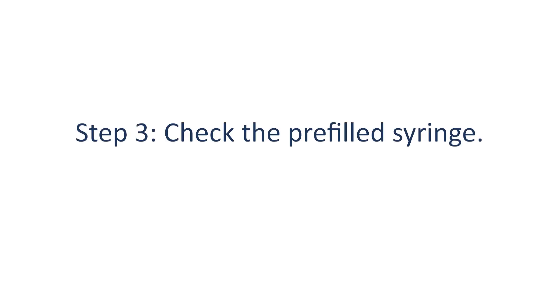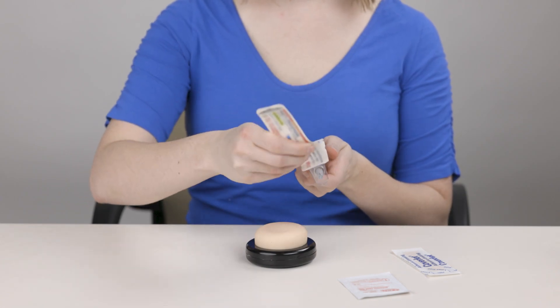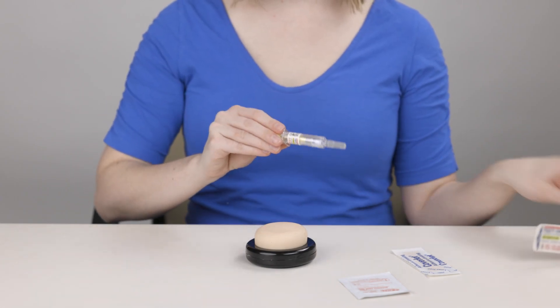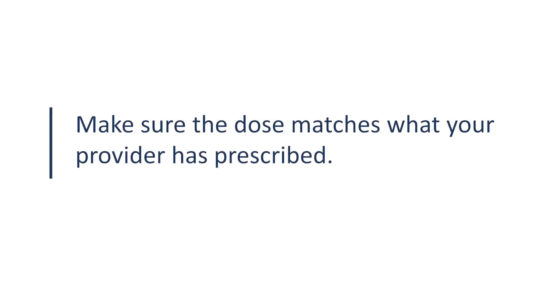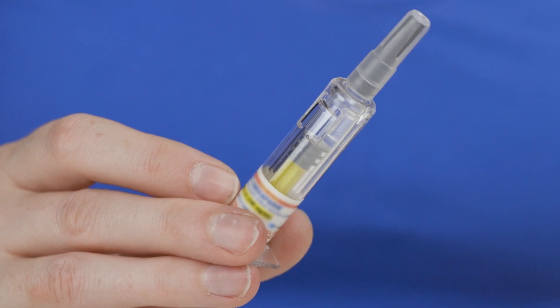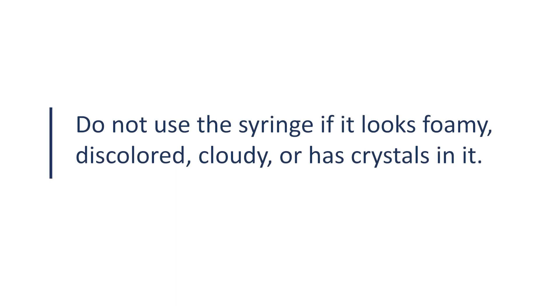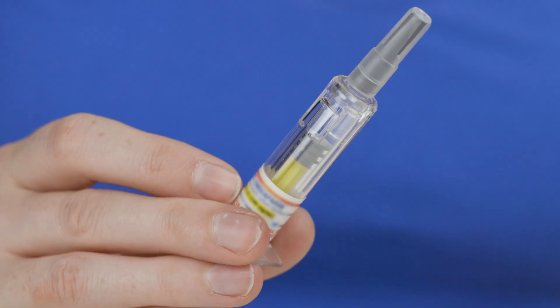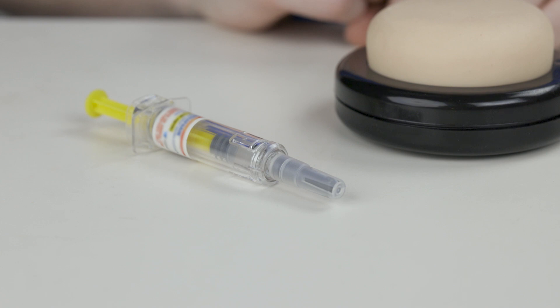Step 3: Check the pre-filled syringe. Take the syringe out of the package and check the medication. Make sure the dose matches what your provider has prescribed. The medication in the syringe should be clear and colorless. Do not use the syringe if it looks foamy, discolored, cloudy, or has crystals in it. After you check the syringe, place it on a clean surface with the needle cap still attached.